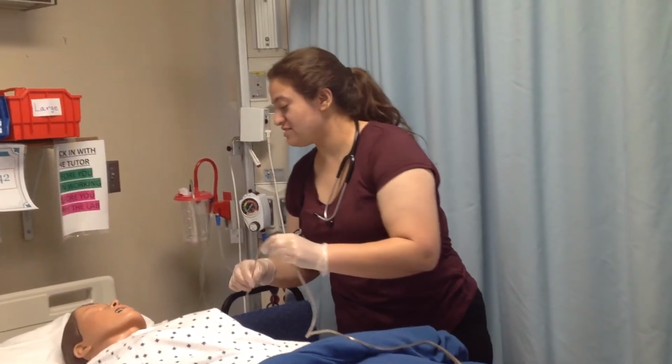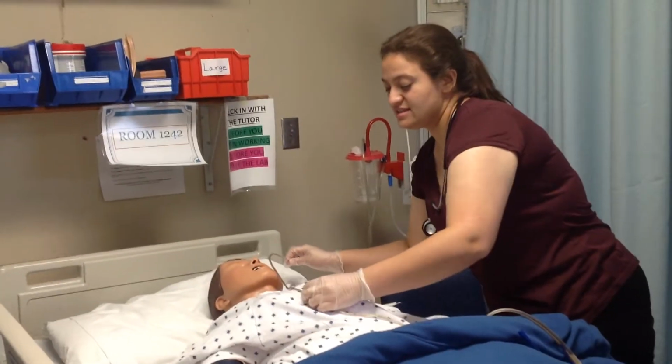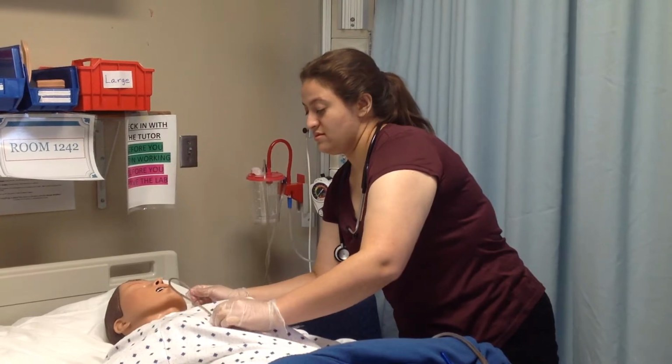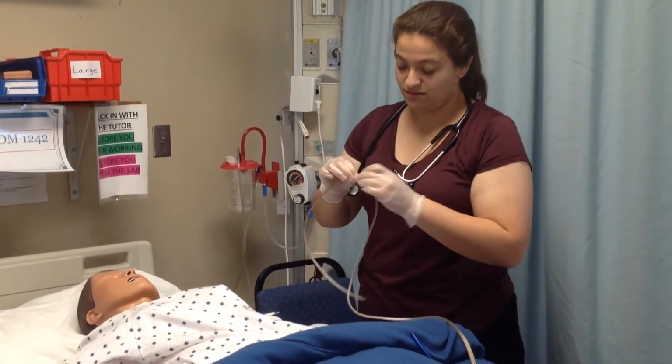So I want to measure from the ear to the tip of the nose, down to the xiphoid process. It's about right there. So 45.